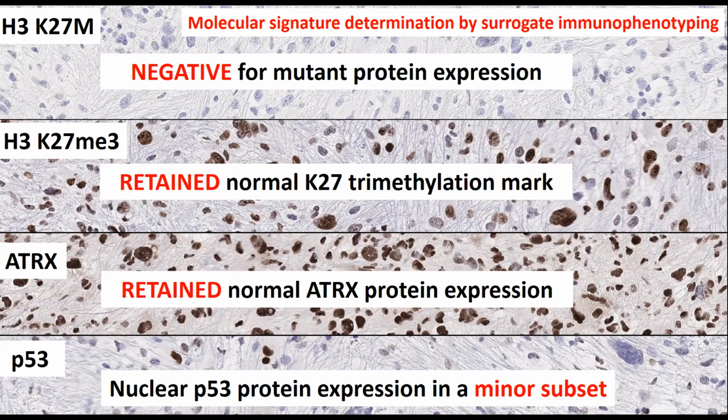This is what normal brain looks like, essentially no staining. Well, if the antibody is directed against an epitope on the normal P53 protein, and you don't see any staining, how can that be normal? And how can positive staining be abnormal? And the answer is, in normal cells, P53 protein is turning over so fast that you do not see staining, all right? Except with cell division, special situations like that, but not in resting G0 cells.